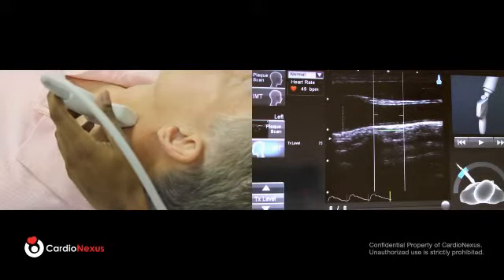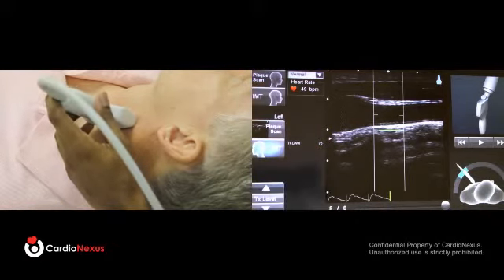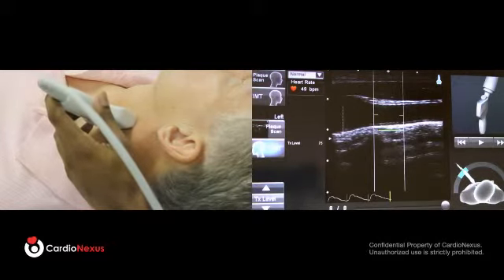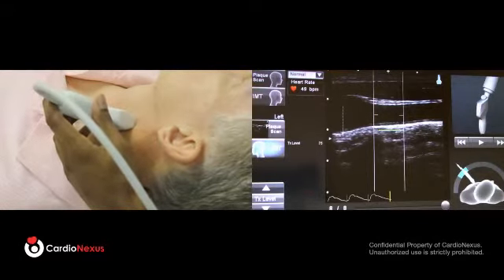Okay, so now the first check is the angle in the correct position, yes. As a second check, is the dotted line in the widest part of the artery? And in this case, I can definitely make out that yes, that is the widest part of the artery. From this view, you're unable to see a flow divider, but again, since anatomy does differ across every patient, you may only see this kind of view or just a widening of the vessel. Once those two checks are complete, the measurement is done.